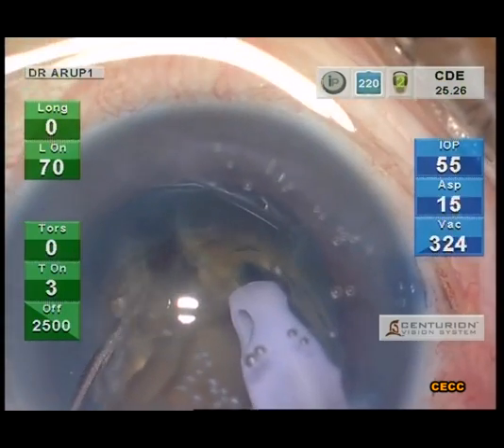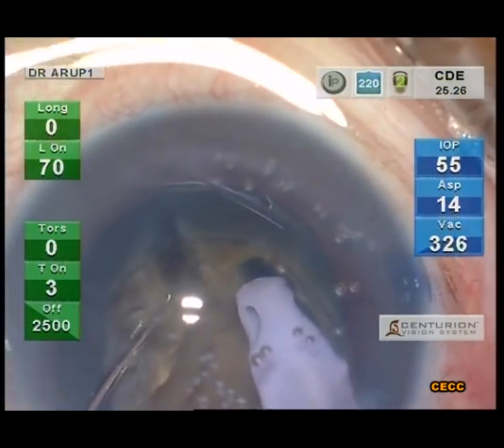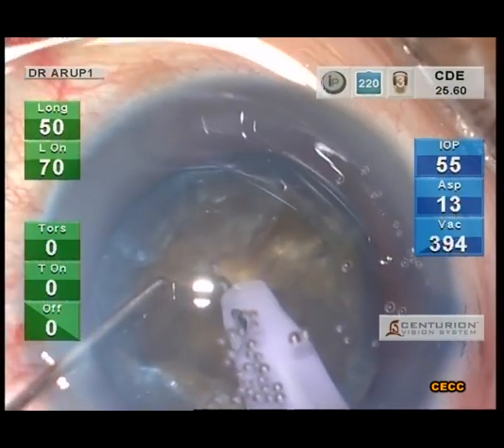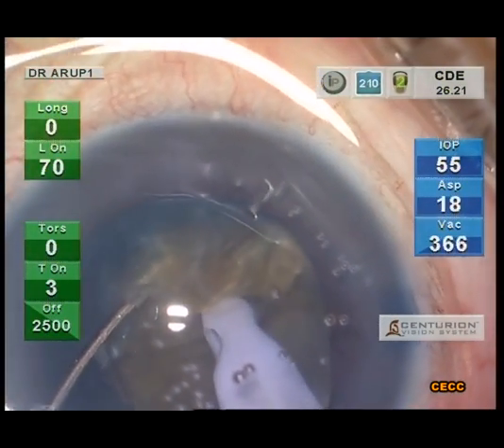The chopping is continued sequentially after further rotating the nucleus. Since the nucleus tended to tilt, with an additional buzz, the phaco tip is driven deeper without breaking the hold so that the chopping can progress at a deeper plane.